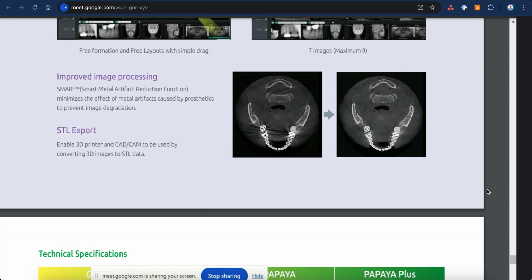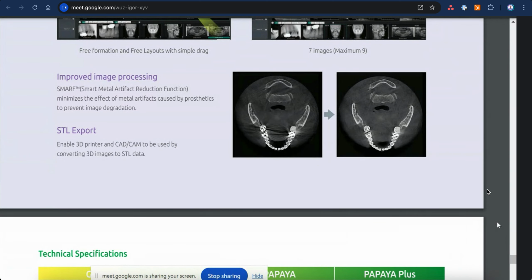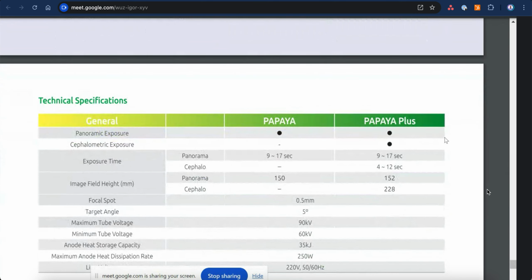The scan abutment, I have explained in the implants before. Then I told you that I can use the digital camera, and then I can get it to CAD CAM just to design the suitable implants that I can fix it in. This is the panorama.